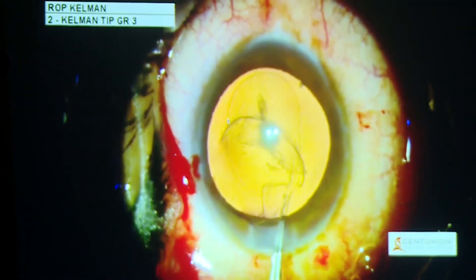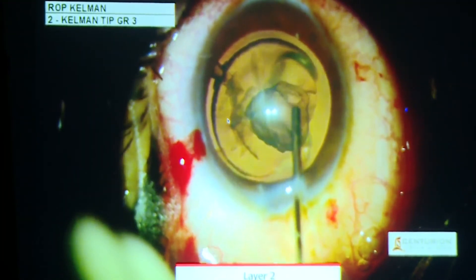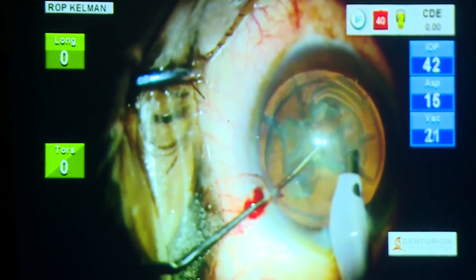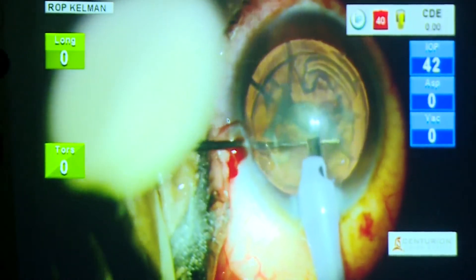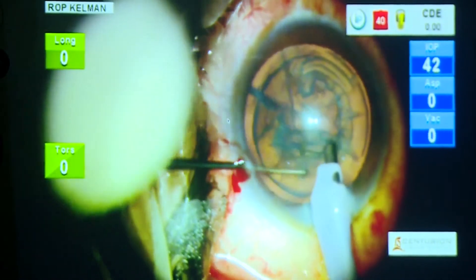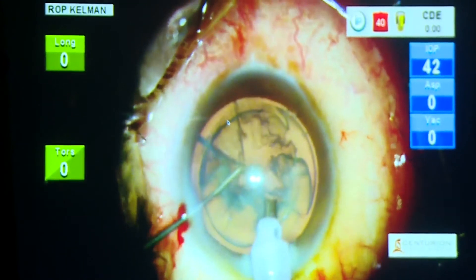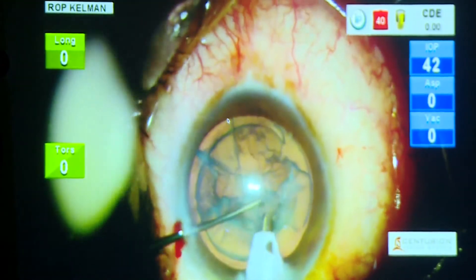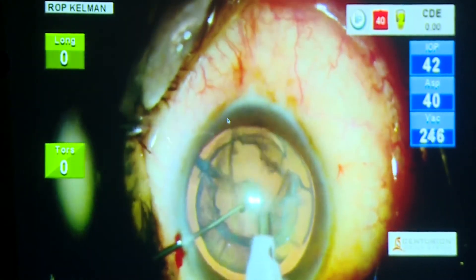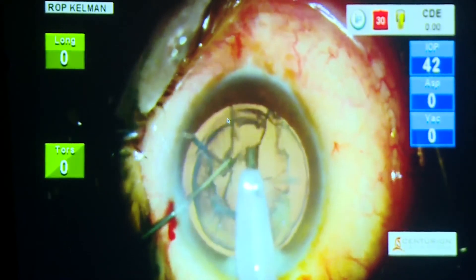What is a rhexis? An oval rhexis, for that matter. You have to create layers because you have to create a situation where the posterior capsule is taken care of. So multiple layering is the answer, because the patient is one-eyed and you want to save everything and put the lens where it needs to be put. Multiple layering, and after that take out the different layers keeping the cushion of epinucleus behind. See how carefully one has to go ahead — layer by layer, leaving a cushion behind is the answer to this situation.